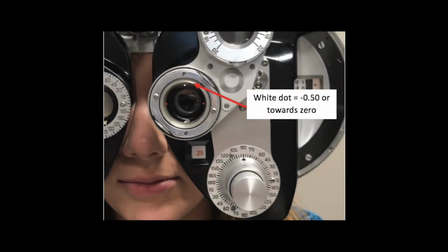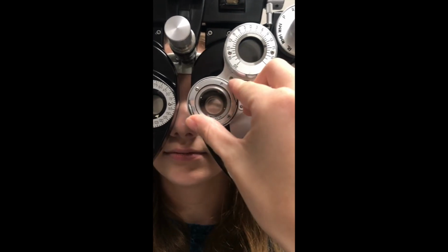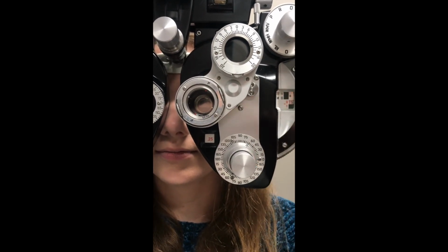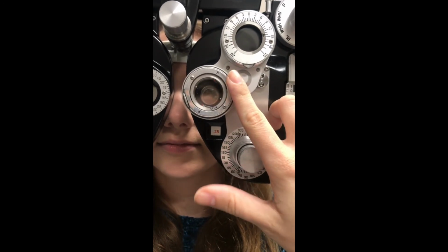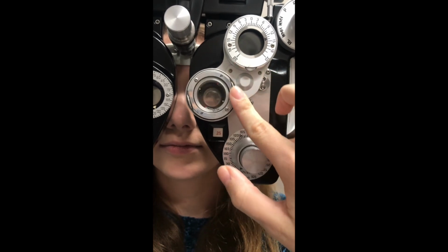We are now on to step number 3, power refinement mode, where the cylinder is refined until the patient rejects the power by responding positively to the choice with the white dots. Remember, the white dots are towards 0 and the red dot is away from 0. And we're going to click in the P, and it is now in with our axis, so we are in power mode. Okay, so let's see, Abigail, do you prefer option 1 or option 2?